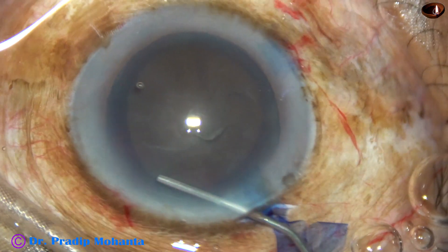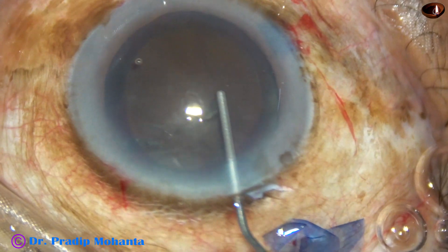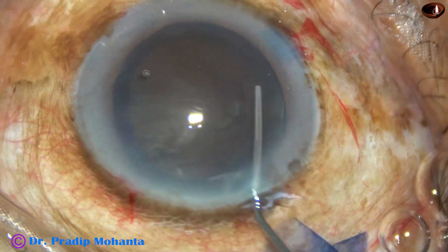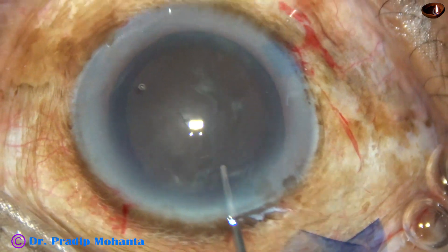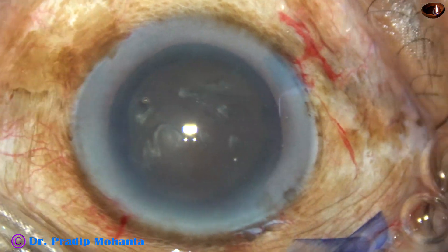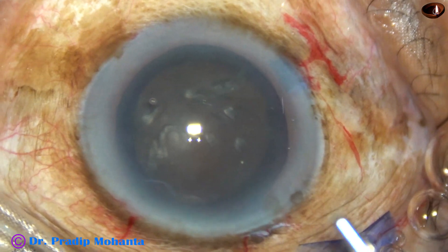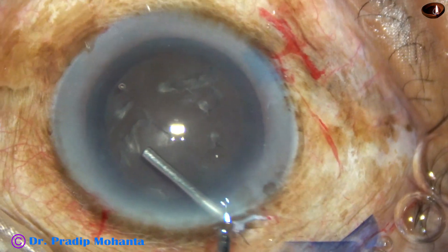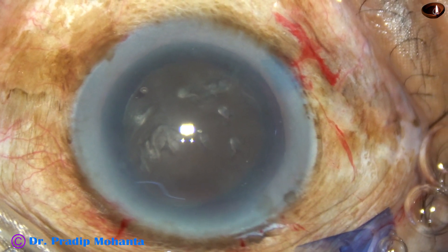The posterior lip of the main wound is depressed, some visco comes out, and then some fluid is injected underneath the anterior capsular rim. The nucleus is nudged. Again, some fluid is injected. And now we find that the nucleus is rotating very nicely. In this case, there is no epinucleus — the epinucleus and nucleus have been fused together.